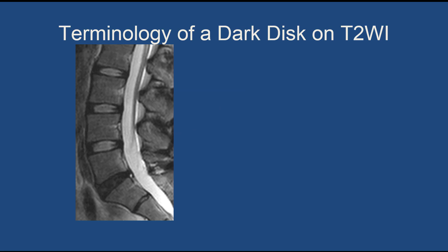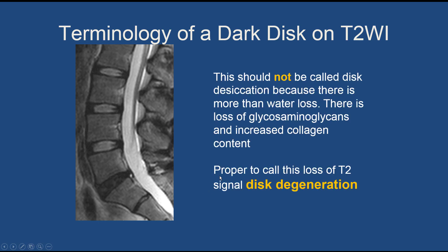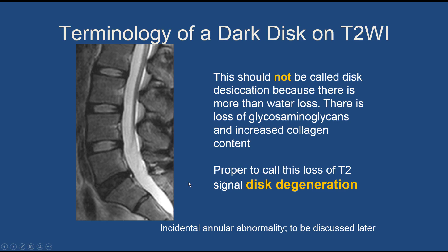Let's talk about the terminology of a dark disc on the T2-weighted image. At L5-S1 you can see a dark disc. It is incorrect to call this disc desiccation, because there's more going on than simple loss of water, which is what desiccation means. There's also loss of proteins and collagen content of the disc. So it's proper to call this loss of T2 signal disc degeneration, not disc desiccation. There's also an annular abnormality visible here, which we'll discuss shortly.